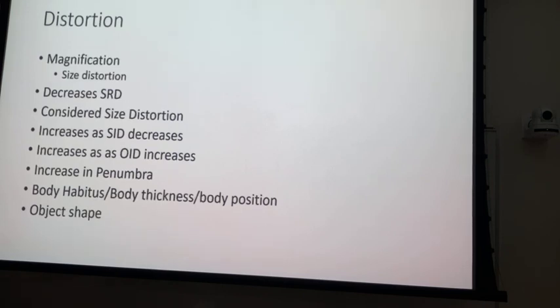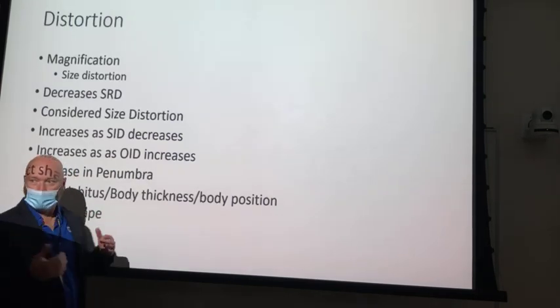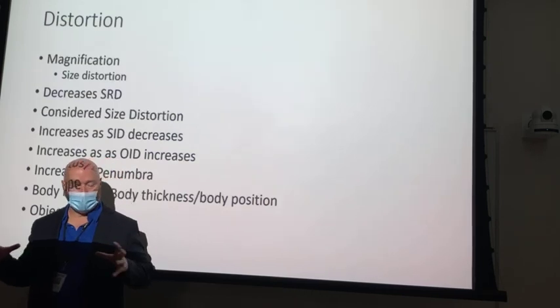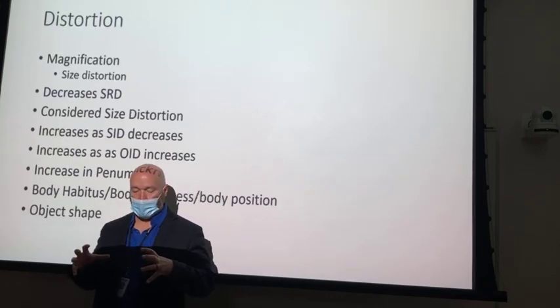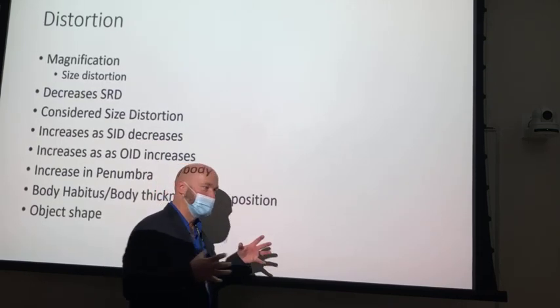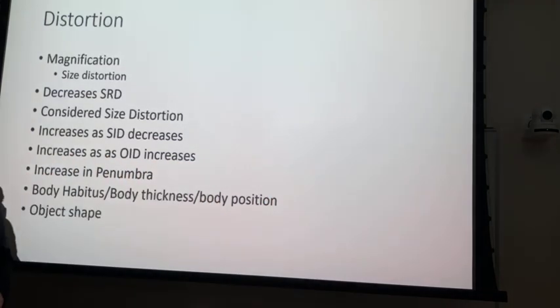A C-spine, yeah, but it doesn't really matter if it's left lateral or right lateral. But what about chest x-ray, right? Chest x-ray, we shoot PA, so we put the heart closer to the image receptor, as opposed to AP, which elevates it, right? Ribs, we talked about ribs last semester. The rib cage looks kind of like this because we've got the sternum and we've got costal cartilage. So as we oblique the ribs, AP obliques put the axillary portion of the ribs closer to the image receptor as opposed to PA, which elevates it, right? So body position can play a part as well.